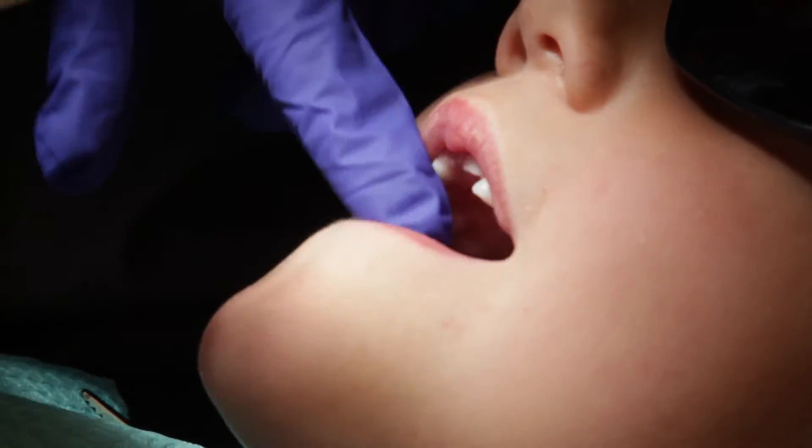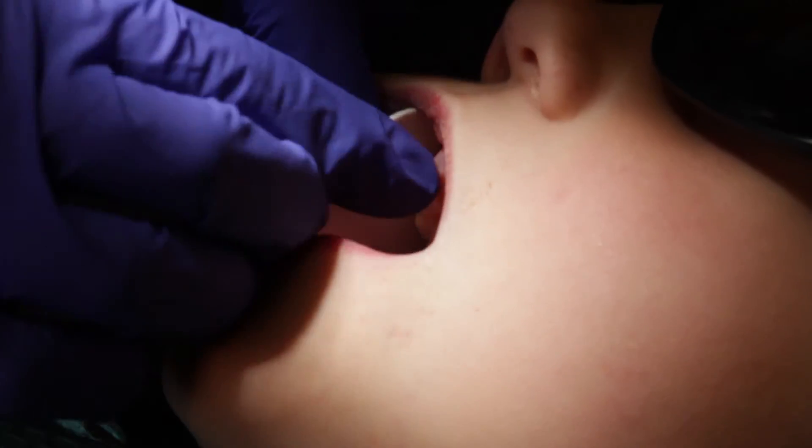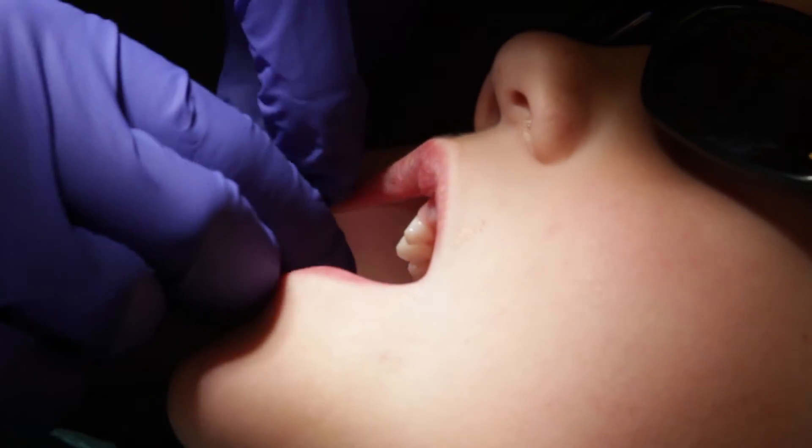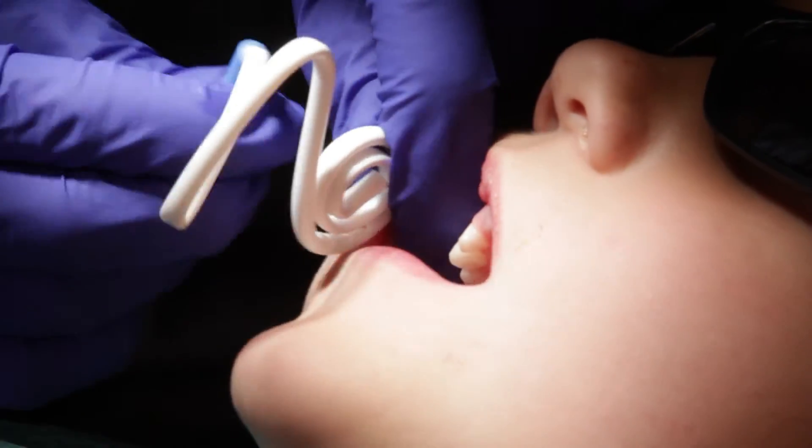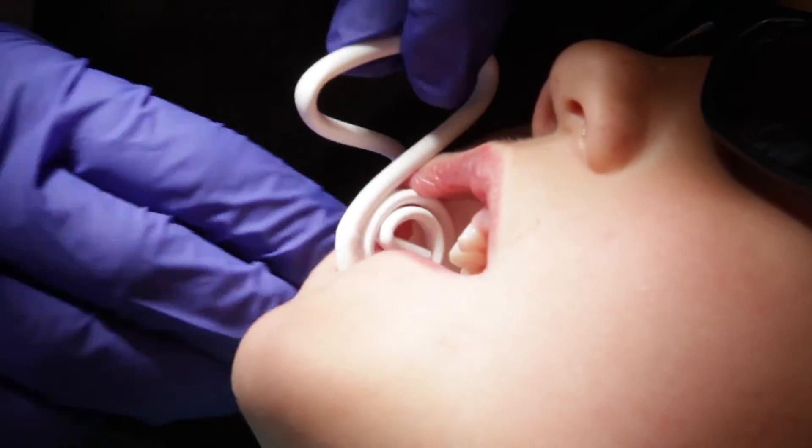Place a dry angle in the cheek. Then, place the saliva ejector over the dry angle. The saliva ejector is low profile — you will notice how well it fits in the cheek of a pediatric patient.